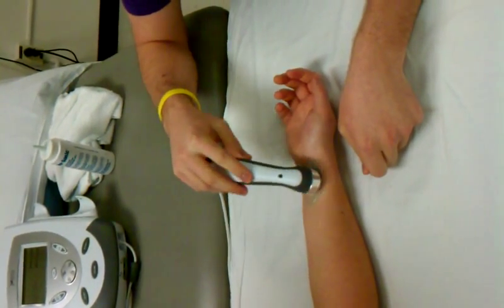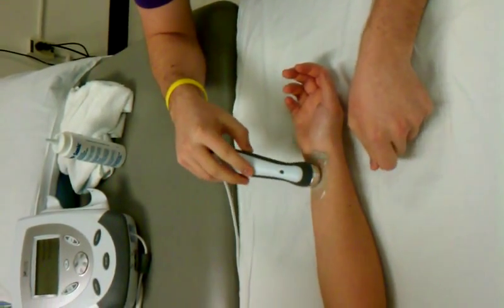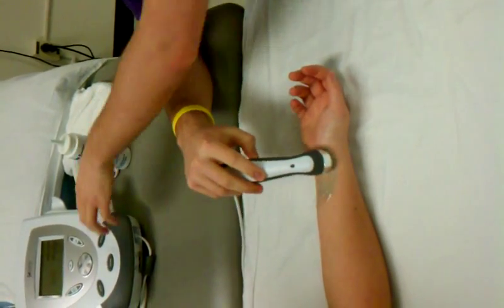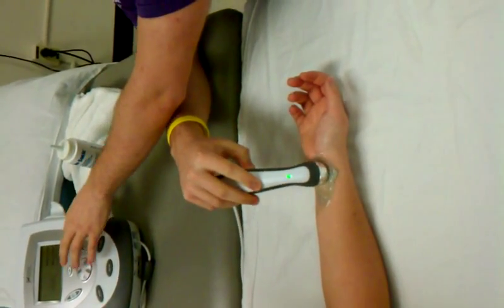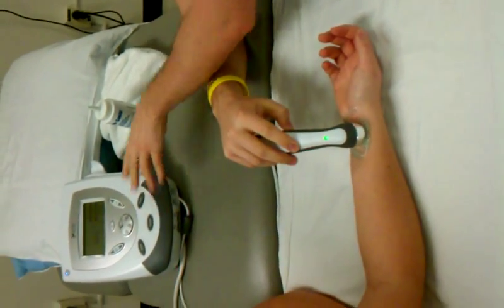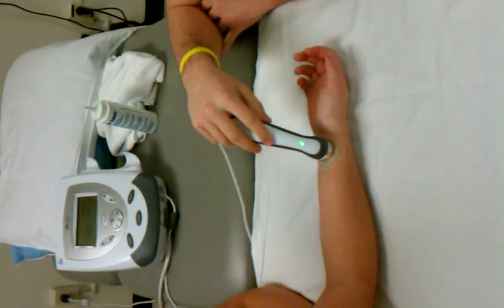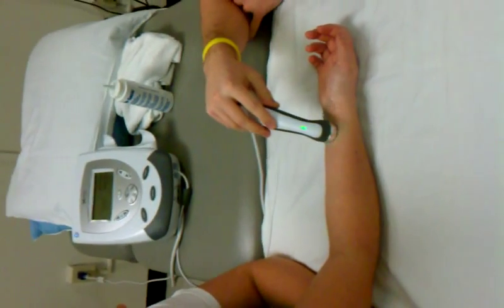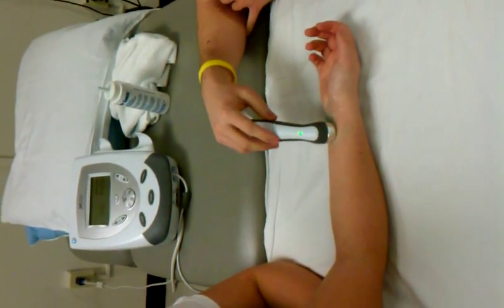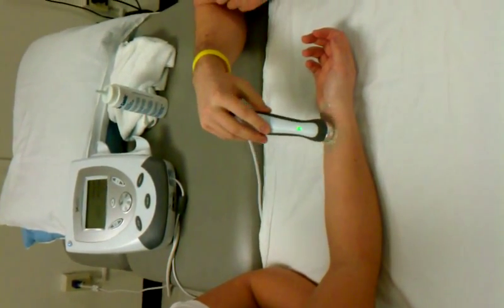So if you feel that hot spot, if you feel anything, let me know and we'll turn it down. Okay? Is that feeling okay? Good. So what I'm doing is just a heating element that's giving you some heat down in that region that's causing the pain down into your hand.